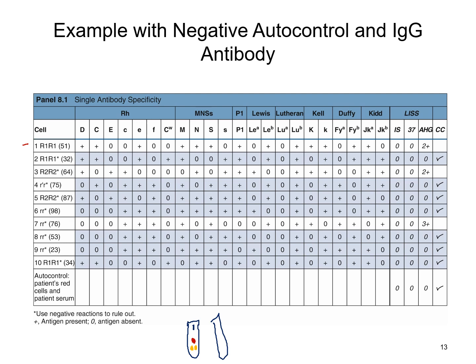So you can see here that, again, remember that we're looking at this particular panel here. They use LISS as their enhancement, but we're looking at these three phases. Again, your check cells is just a check. Just because it checked or it worked, it was positive. Of course, some labs will grade these, usually 1+ to 3+ type of reactions here. If those check cells work, that just validates that your AHG worked, that phase of testing is valid. So we don't consider this a positive reaction, only the reactivity that happens within the three phases.